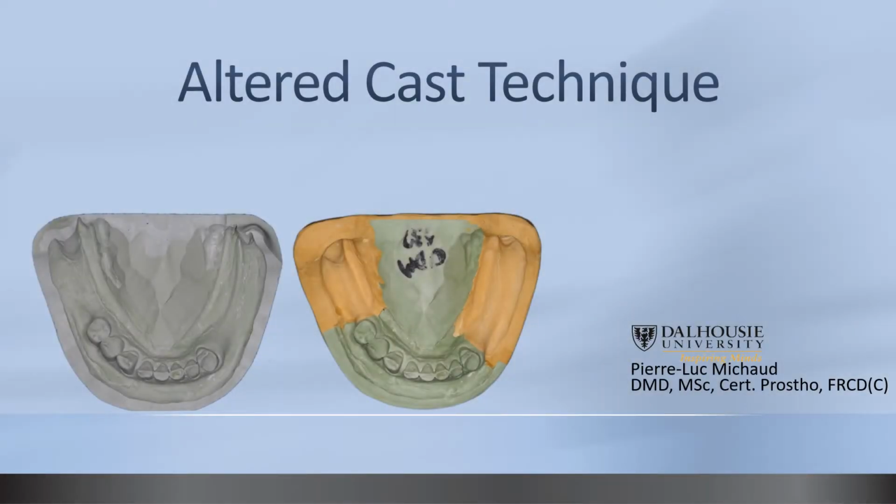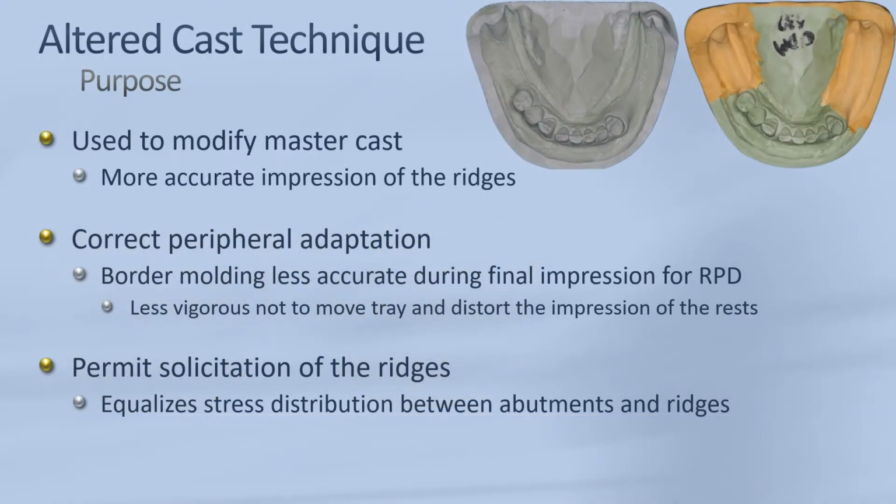This presentation is going to pertain to altered cast techniques. We will discuss when this technique would be indicated, what the advantages are, and how to do it. There are different reasons why an altered cast impression may be warranted.